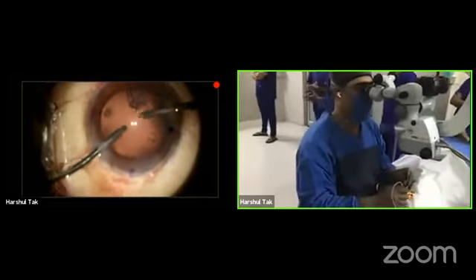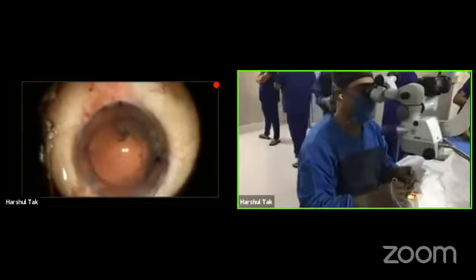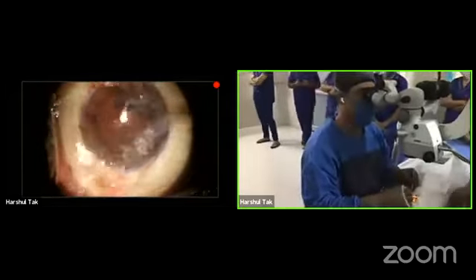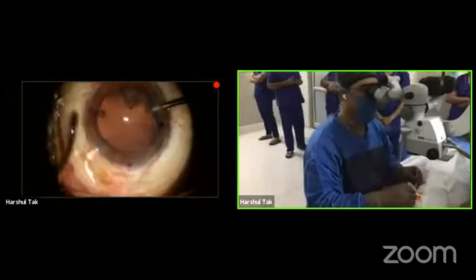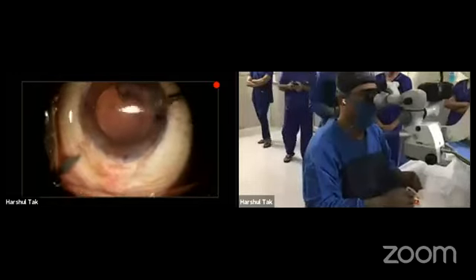So in bimanual, whenever you finish this 180 degrees, go ahead and change your hands. Don't try to go in angles. That's the real advantage of your system.